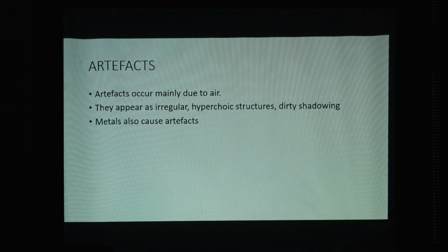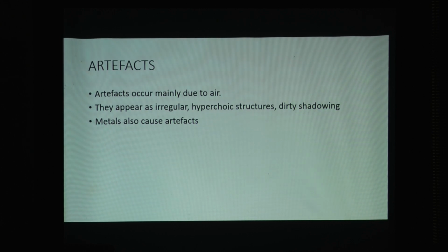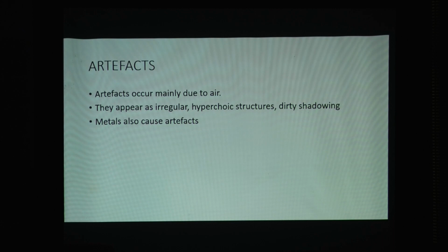Then artifacts may occur due to air, reverberation artifacts, etc. They appear as irregular hyperechoic structures with dirty shadowing. Metals also cause artifacts. But we will be able to identify the presence of air by these artifacts. You see, a calcification will be stationary, whereas air will move and will be seen as dirty shadowing. That is very important to identify the presence of air in the tissues, like emphysematous cholecystitis, nephritis, etc.